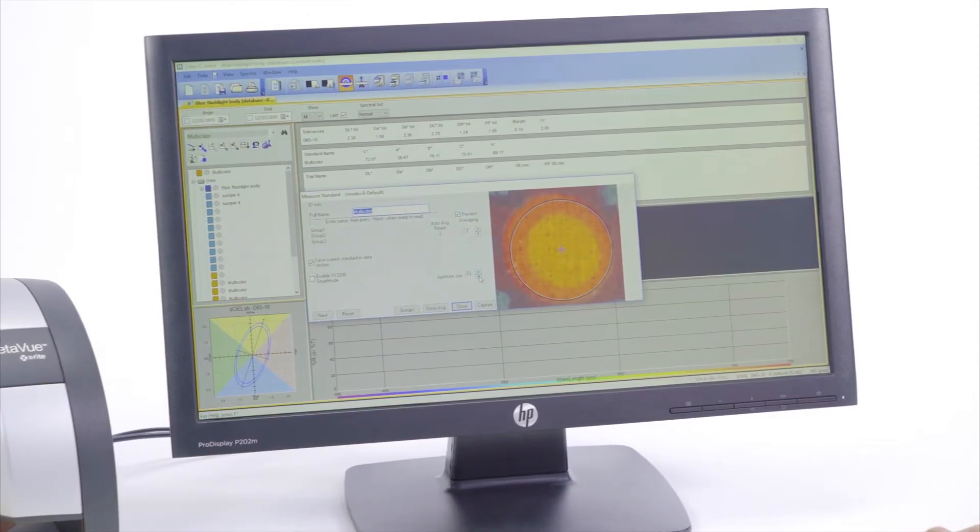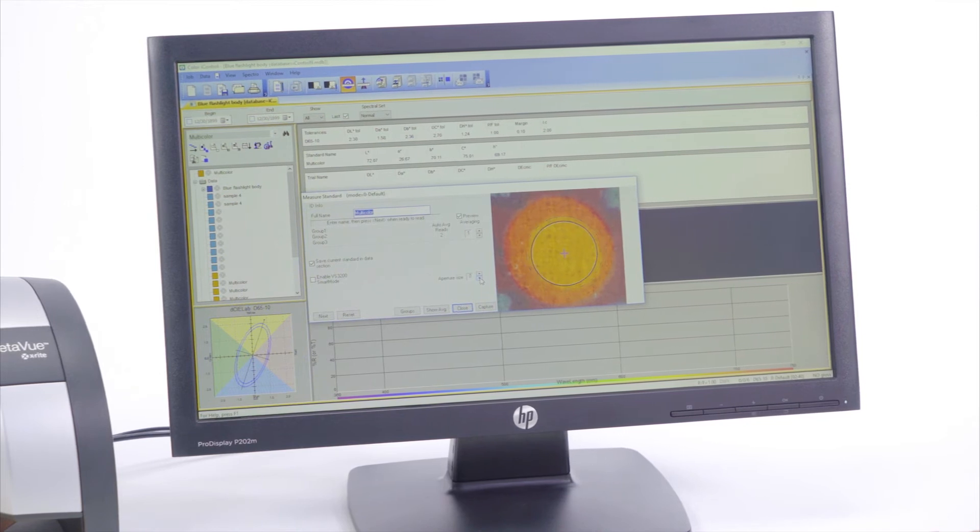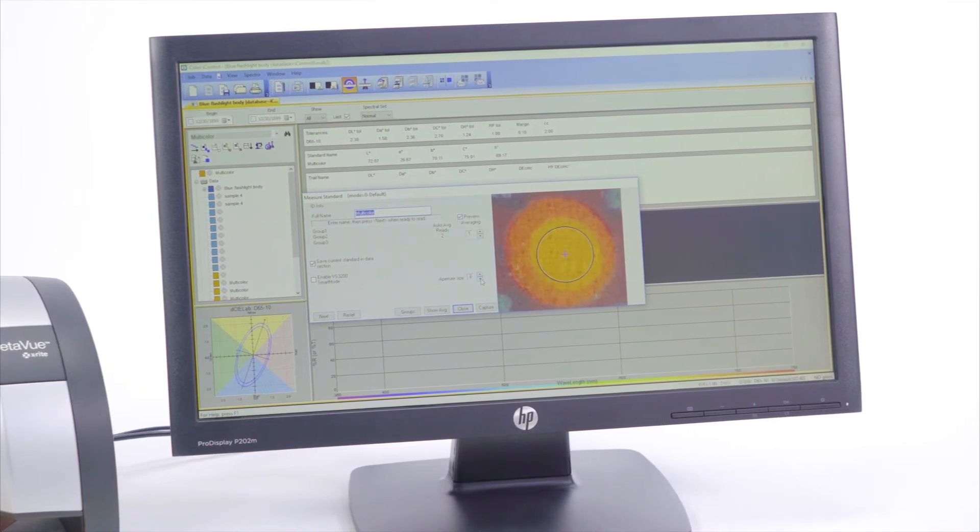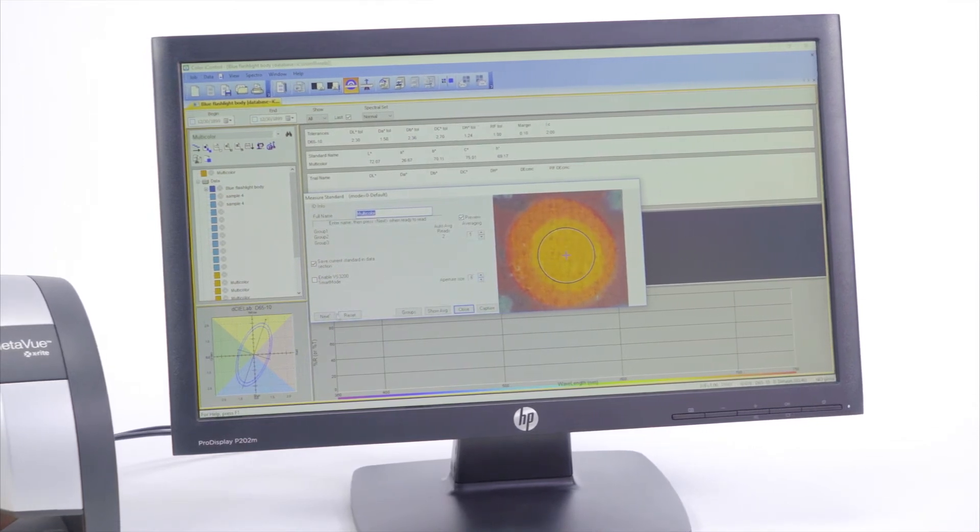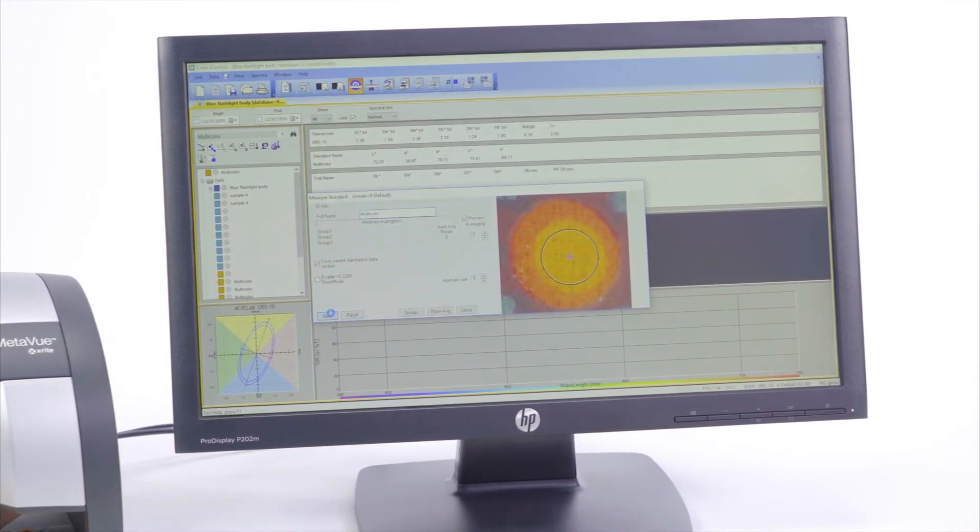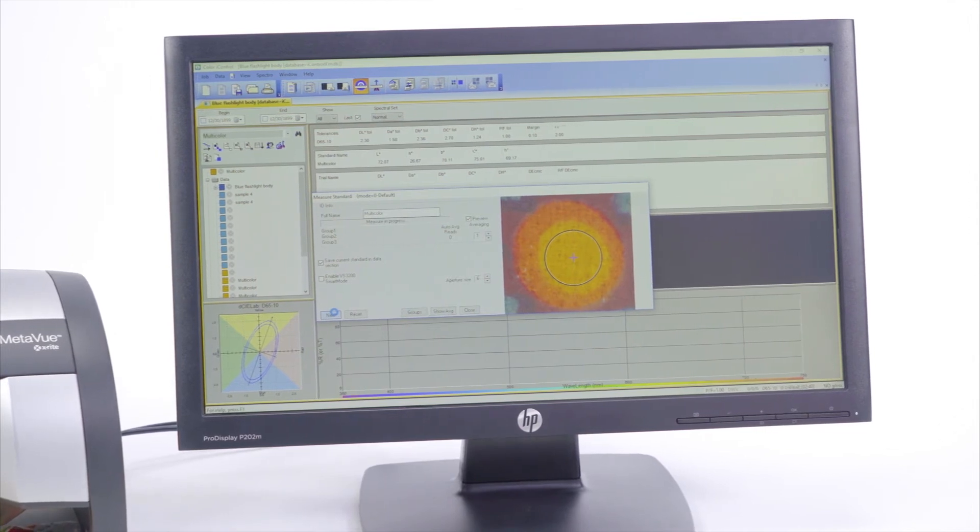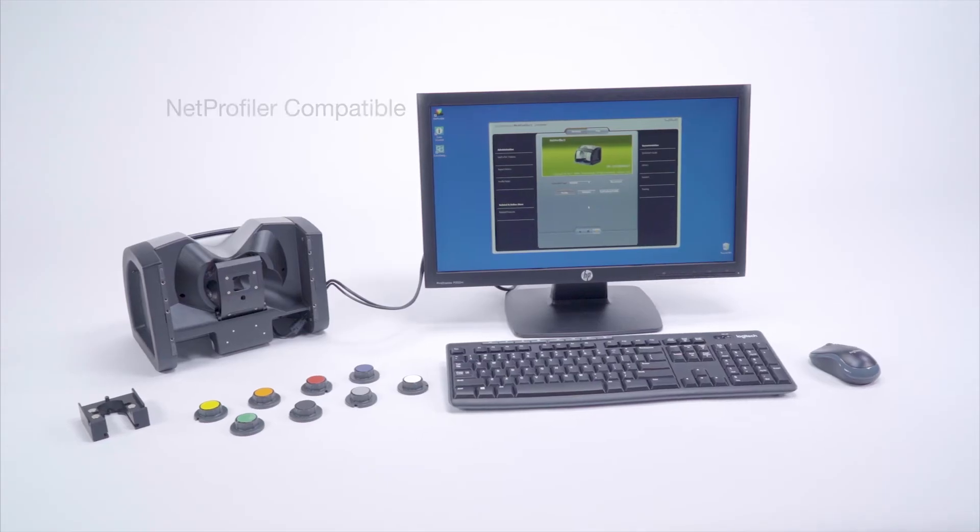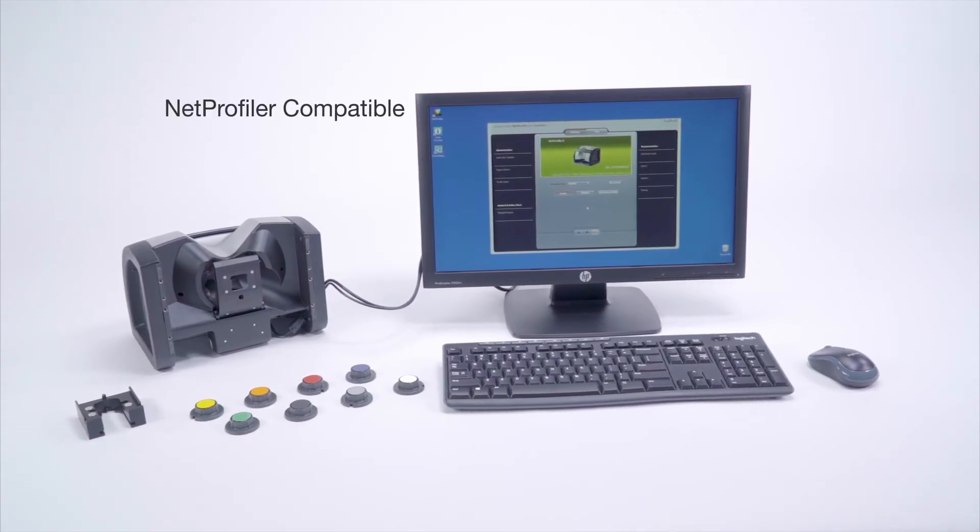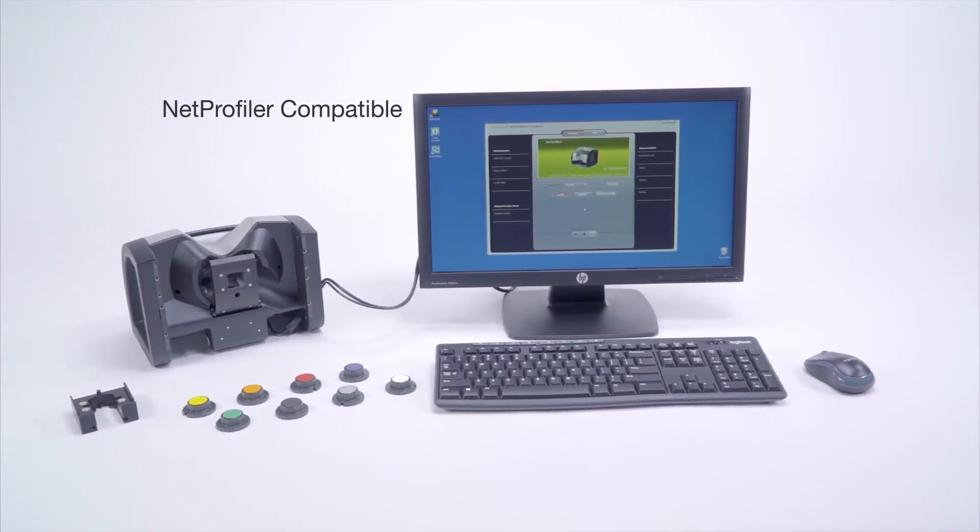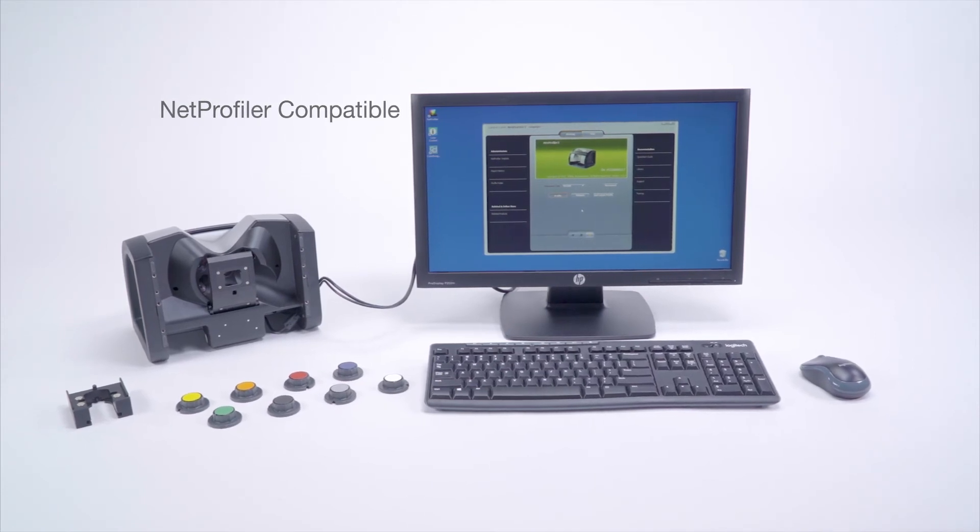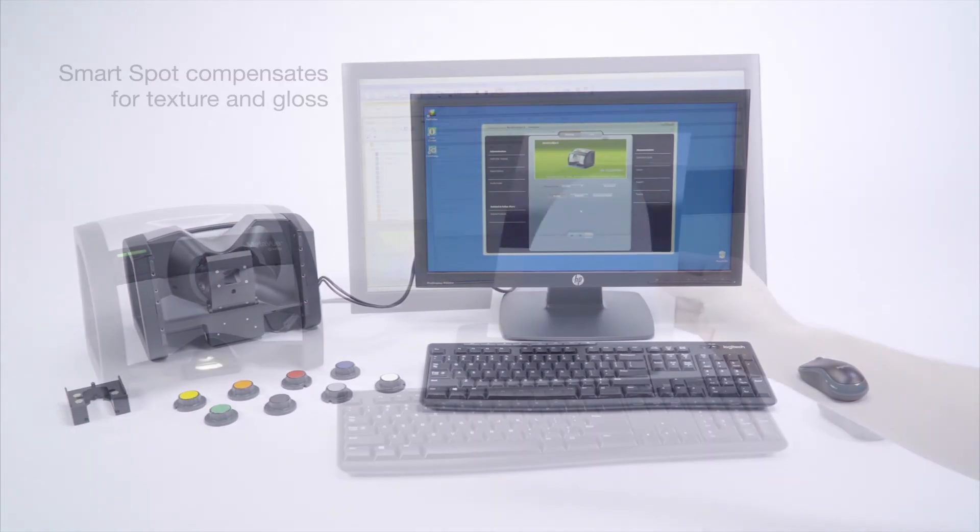MetaView also delivers fast and dependable quality control and formulation when integrated with X-Rite Pantone's ColorIQC or Color iMatch software. Furthermore, it is compatible with NetProfiler, which enables performance verification and optimization in the field.